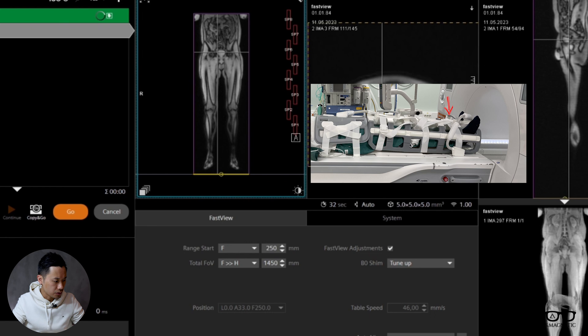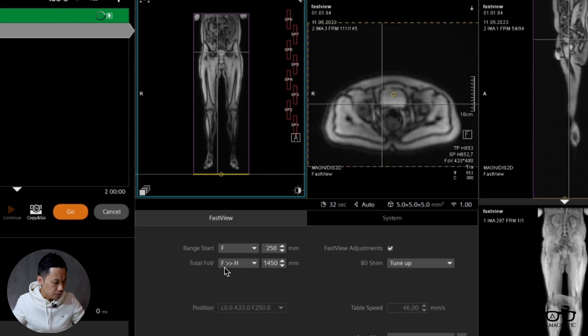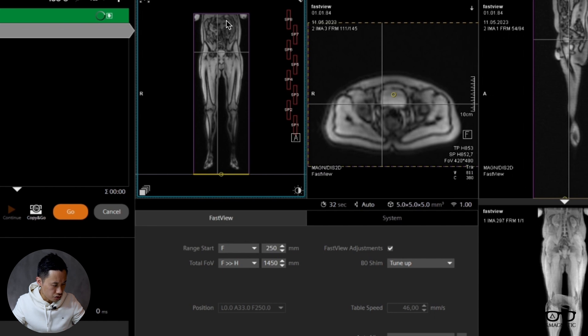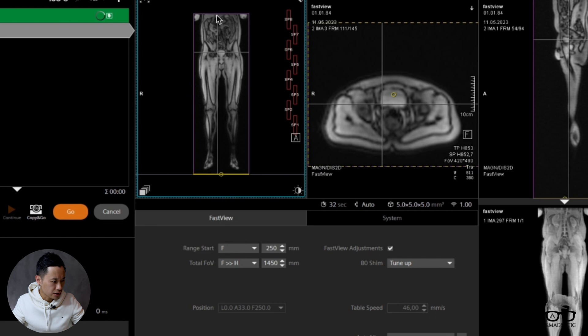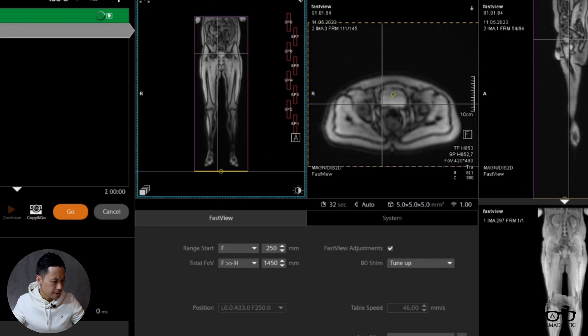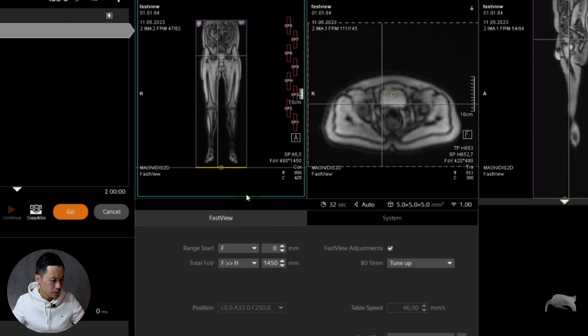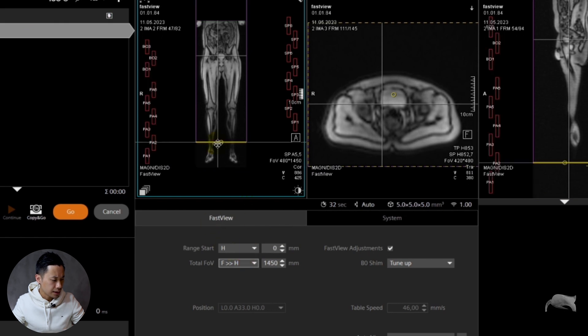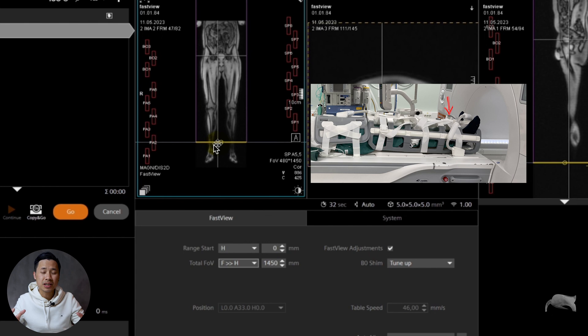Feet to head is 1450 millimeters—that's the range you want to image. You can adjust this range if you only want to have it to the hip, for example. Let's put zero. Zero means it goes up.